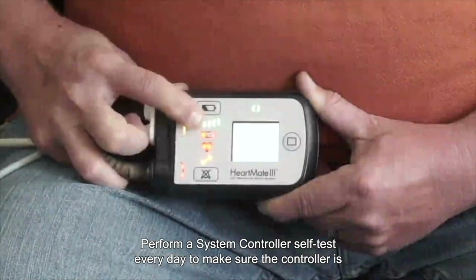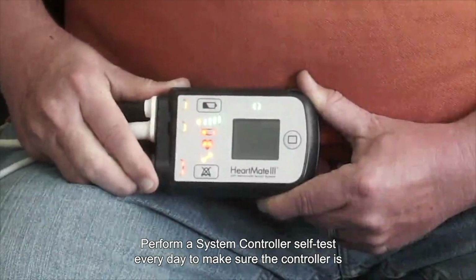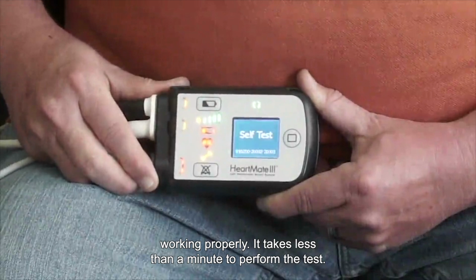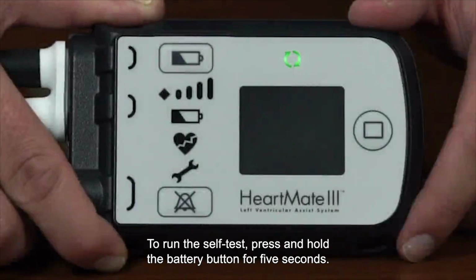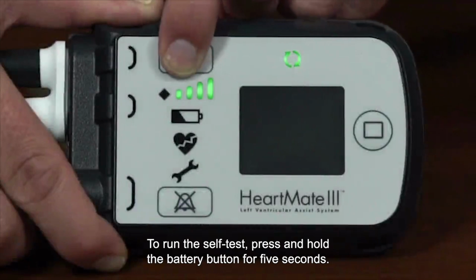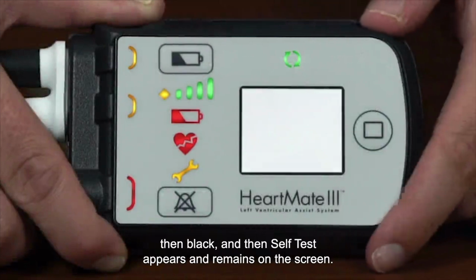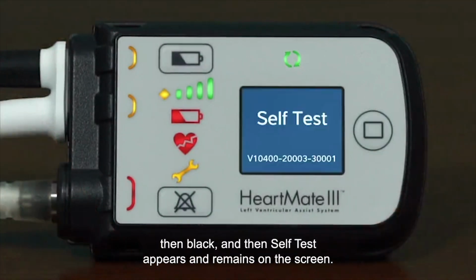Perform a system controller self-test every day to make sure the controller is working properly. It takes less than a minute to perform the test. To run the self-test, press and hold the battery button for 5 seconds. The screen first briefly turns white, then black, and then self-test appears and remains on the screen.